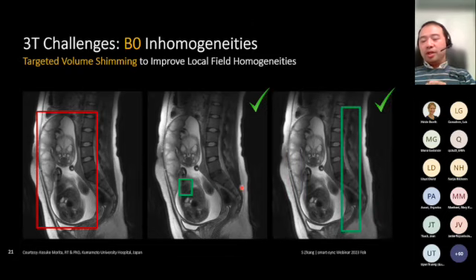Another way, because the fetus may move around a little bit, is to position the box posterior to the fetus in the mother's back area. We have general good feedback from people who are scanning fetus in general. If you are interested in the fetal heart, why not also have a try?